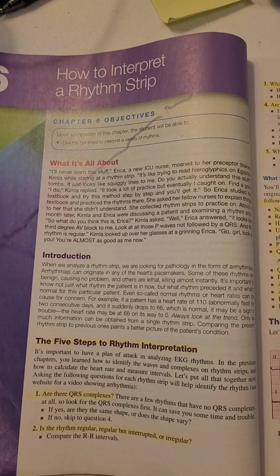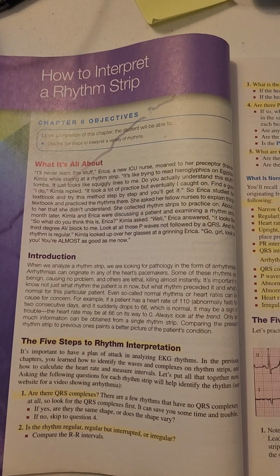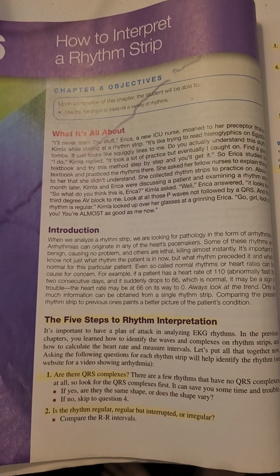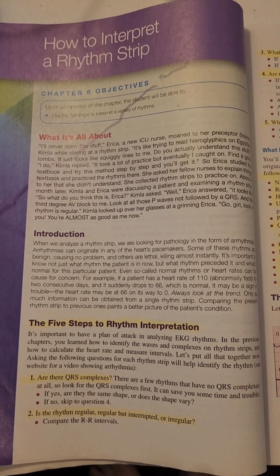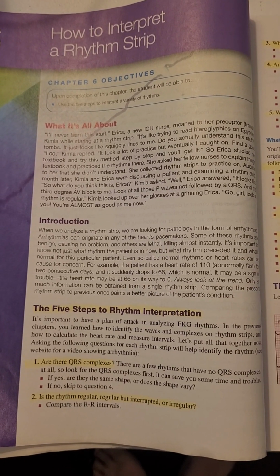It's important to know not just what rhythm the patient is in, but what rhythm preceded it and what's normal for this particular patient, because every patient is different. You have to make sure that you're on the same page with the nurse all the time. Still, you should be looking out for lethal rhythms. Even so-called normal rhythms or heart rates can be cause for concern.